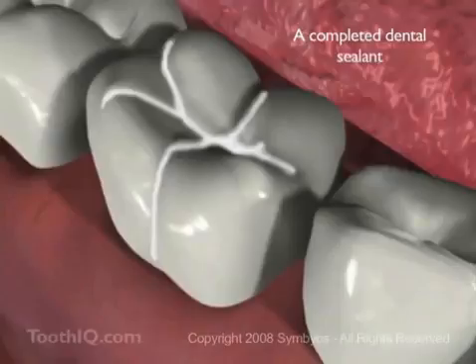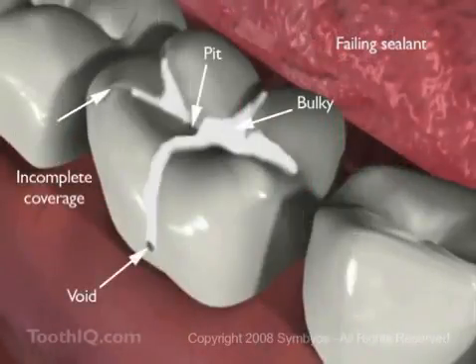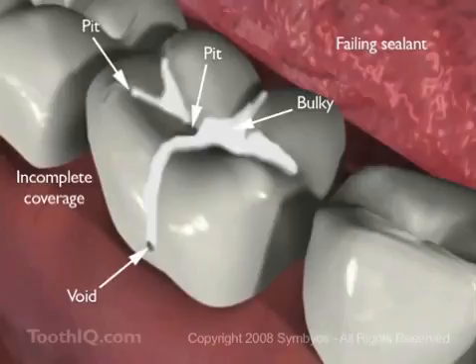And remember to see a dentist regularly to have the sealants evaluated for signs of failure, part of any thorough oral exam. Left alone, a poorly contoured failing sealant like the one shown is at least as prone to decay as an unsealed tooth.